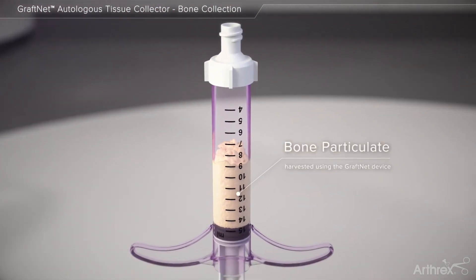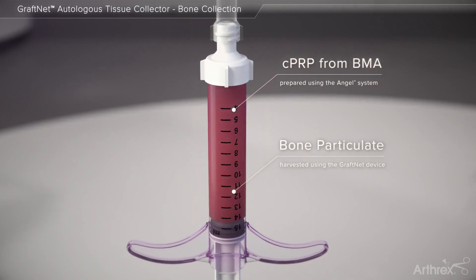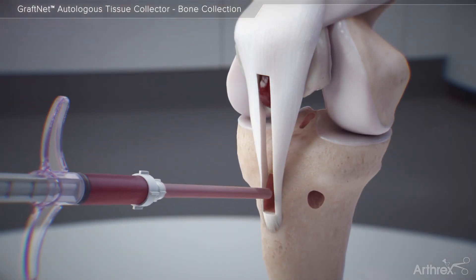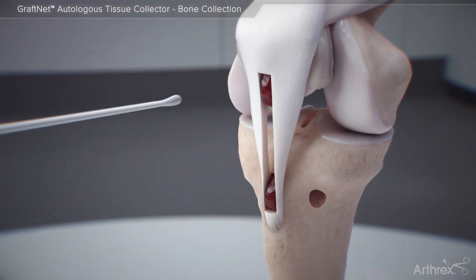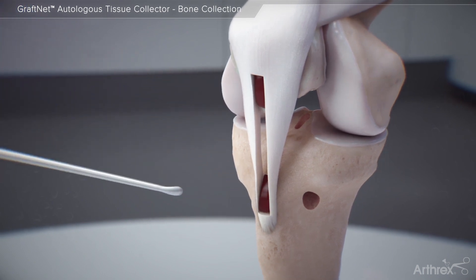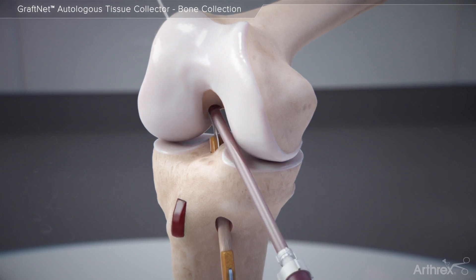Following mixing of the collected bone graft with concentrated PRP from the ANGEL CPRP system, the graft may be delivered to fill the BTB harvest site or to fill the ACL tunnels when delivering the ACL graft.